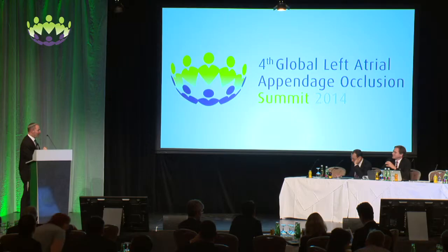The question and challenge is going to be, if you adopt the approach of doing CT scans or MRs on all of these beforehand, will you be able to pick the cases where you're going to benefit from that? I think in the massive cases, that's not going to be the case.